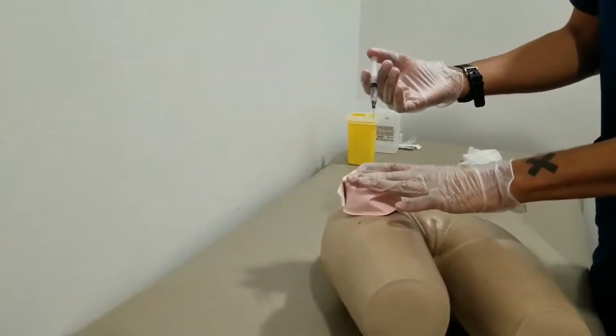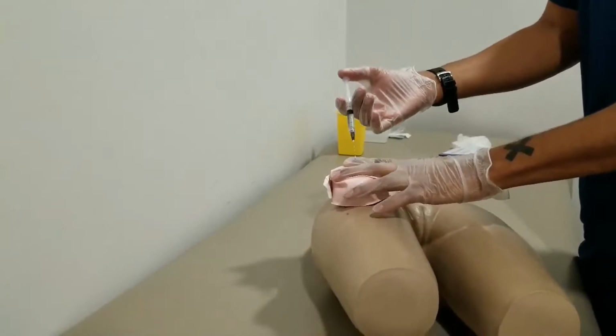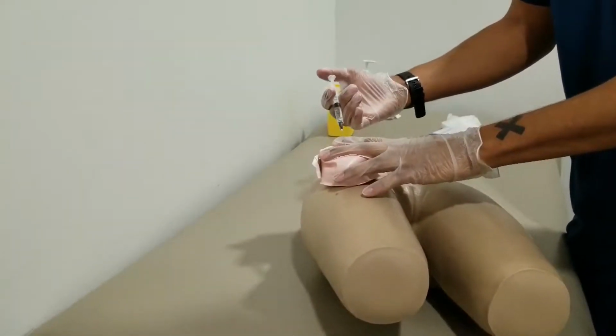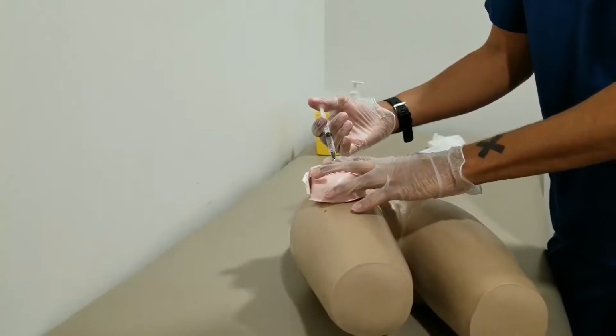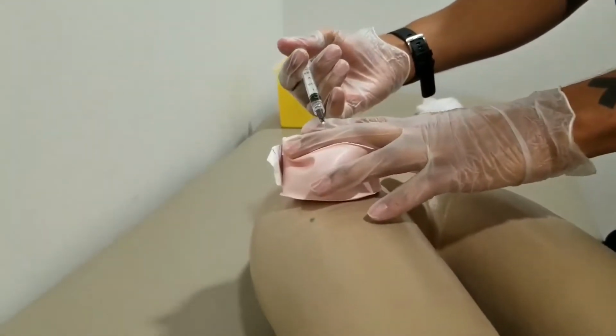At a 45-degree angle around the anterior portion of the quad, making sure the bevel is facing up. I'll go swiftly but quickly and slowly inject the volume.